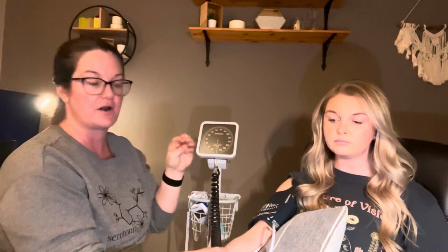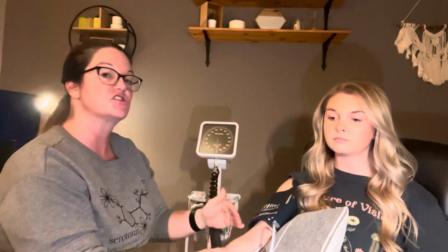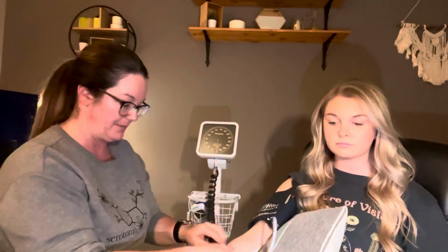So when we do a two-step blood pressure, we're doing that to rule out an auscultatory gap. An auscultatory gap or a silent gap is when there are Korotkoff sounds and then they diminish or are absent and then they return. So by ruling out an auscultatory gap, we're making sure that we're getting a true systolic reading and not an underestimated systolic reading. All right, so we've bled the cuff off. Now I move to the listening part.